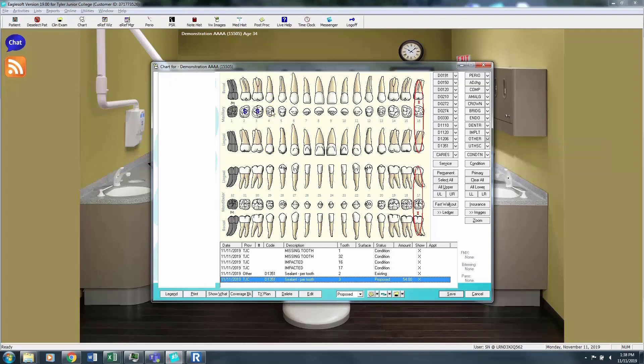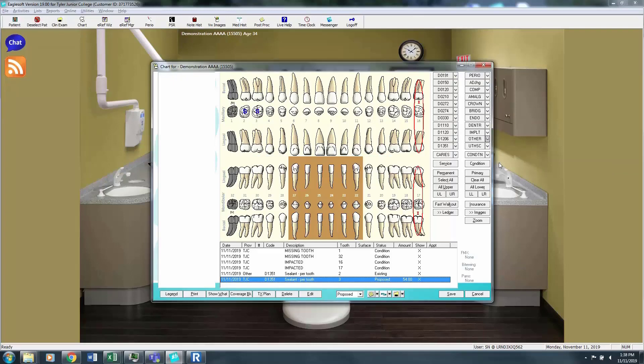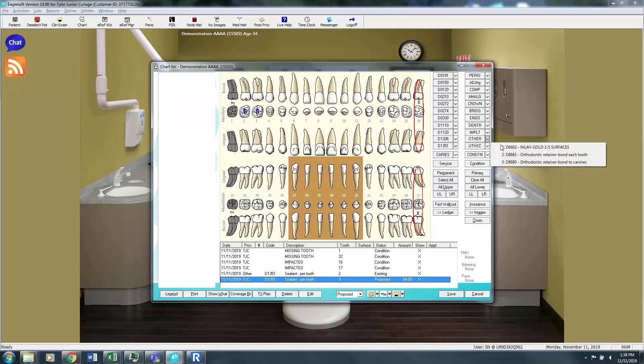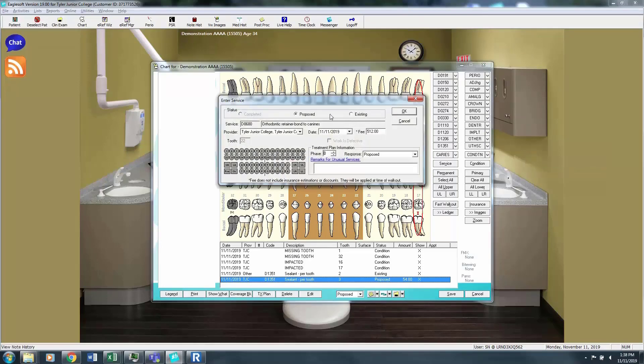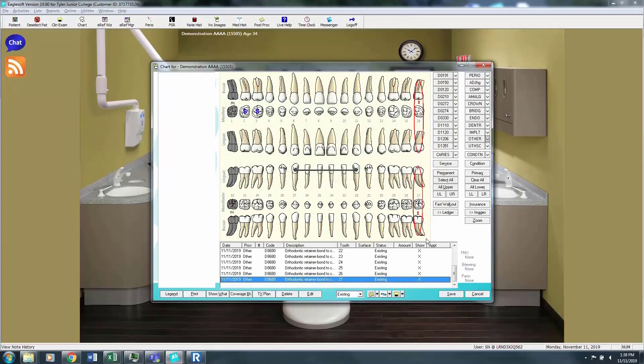So if this patient had a lingual retainer, I would click the teeth that are connected by the retainer, click other and choose which one. Is it bonded each tooth or is it canine to canine? It's existing and it's going to throw the bar across the linguals.